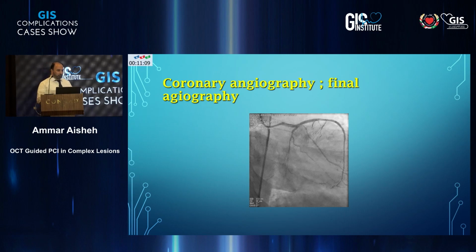So I think, Dr. Mohanad, about the undersizing with OCT, because if you just depend on the software to give you the size, you might undersize. But if you do it media to media, as you do with IVUS, then you will get proper sizing, or it's usually 0.5 above the luminal diameter, if the external elastic lamina is not very clear.